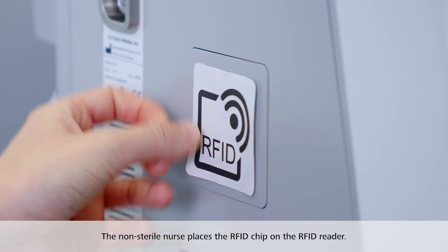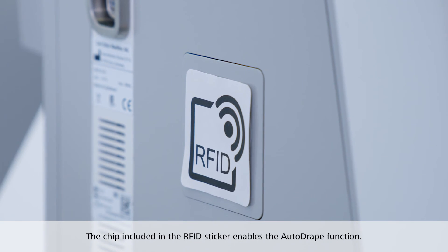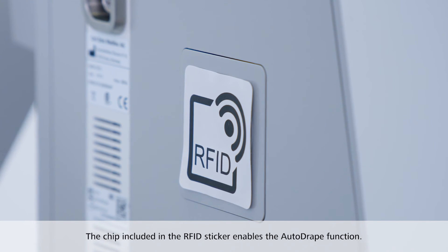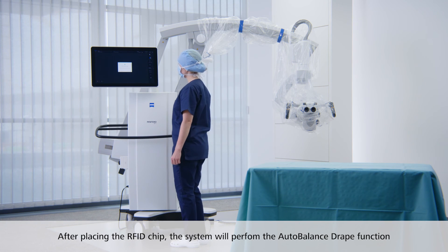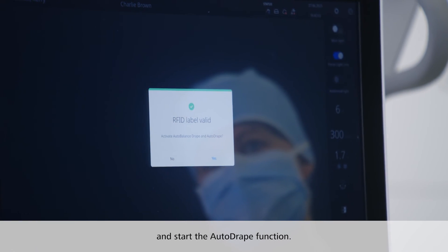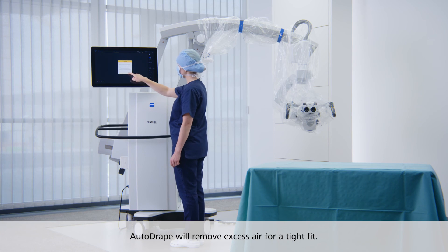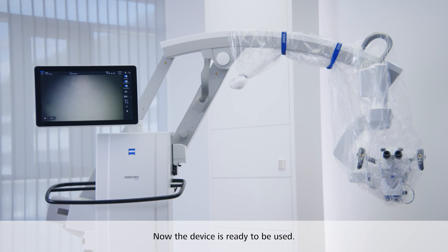The non-sterile nurse places the RFID chip on the RFID reader. The chip included in the RFID sticker is unique to each size SmartDrape and enables the auto drape function. After you've placed the RFID chip on the reader, the system will ask you to perform the auto-balance drape function and start the auto drape function. Confirm the message to continue. The auto drape function will remove excess air from the inside of the drape for a tight fit. Now the device is ready to be used.